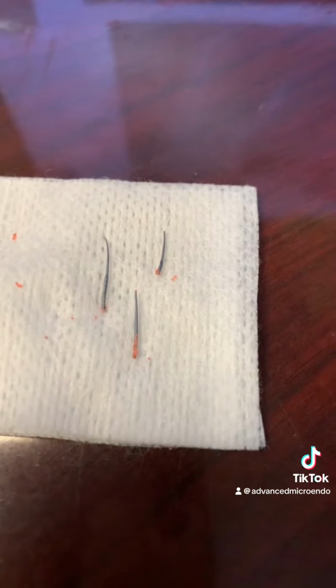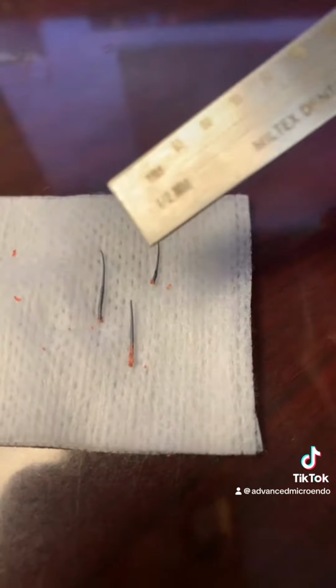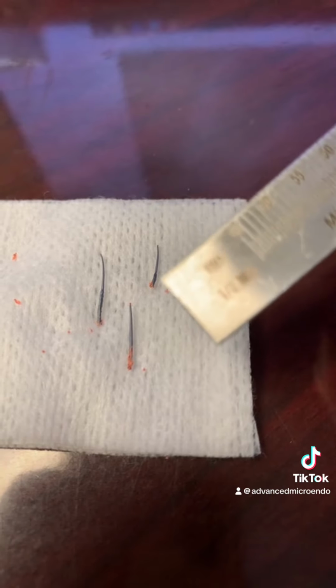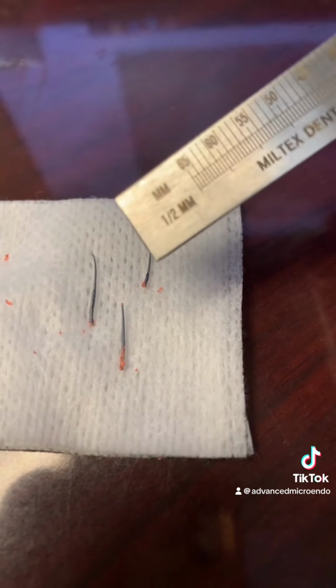These are the plastic thermafil obturators I pulled out of the canals. Okay, so this came out of the mesiobuccal, this came out of the mesiolingual, and you can see how short it is because, as I said, the dentist didn't instrument all the way to the working length in the mesiolingual, nor did he or she instrument and obturate the distal canal, and missed the canal on the distal as well. But that came out of the distal canal. This came out of the mesiobuccal, mesiolingual, and again, that came out of the distal canal.